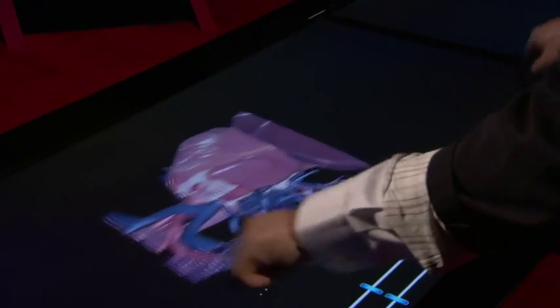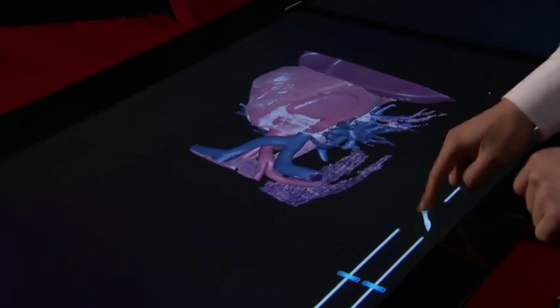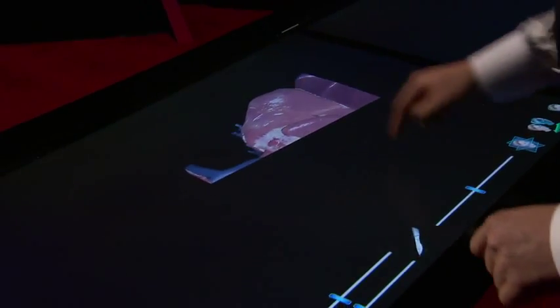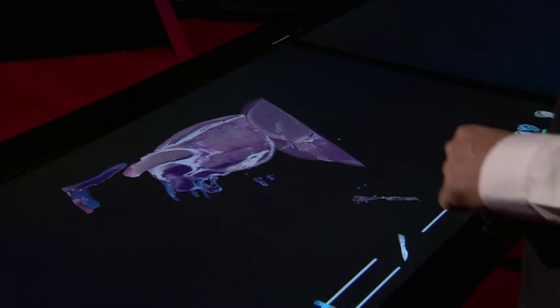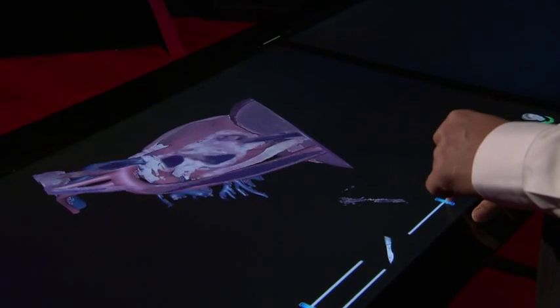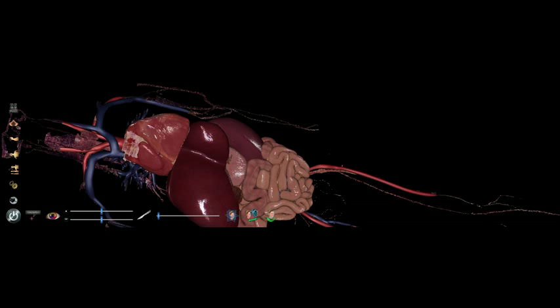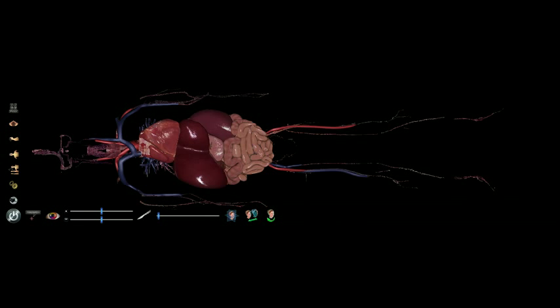Let me zoom in. I'm going to make a cut right there, and you can see the inside of the heart — you can see the atrium and ventricles, how blood flows to arteries and veins. Just like this, students can isolate any body part and dissect any way they want to.